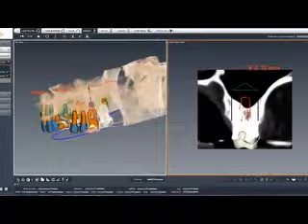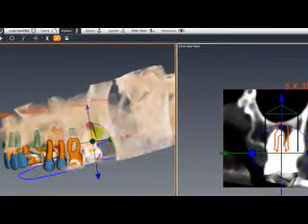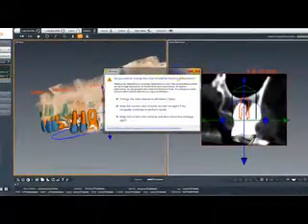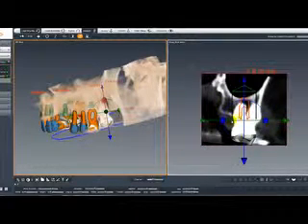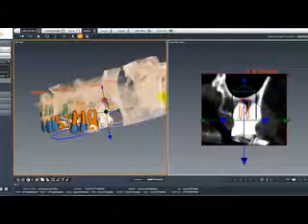Number 15 is going to be a 5.0 by 10 millimeter implant as well, and the reason for that is distalizing this implant towards the distal root so we can engage some more fresh bone that's in there. We could use a 10, or we could use an 11.5 if we're going to be doing a sinus graft in here. I would choose both of them to be 11.5 millimeters and put some more bone in the sinus floor. So you're going to have to make some decisions in this case and let me know exactly which implants you would like to keep and which implants you would like to remove. I will give you my recommendations in a moment.